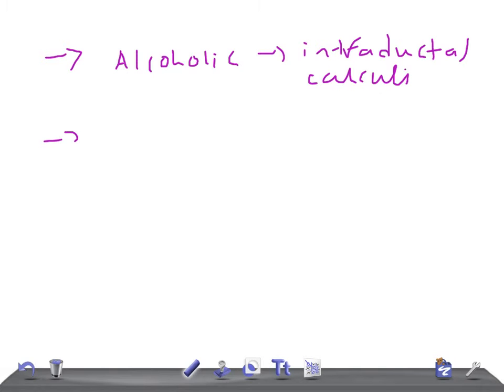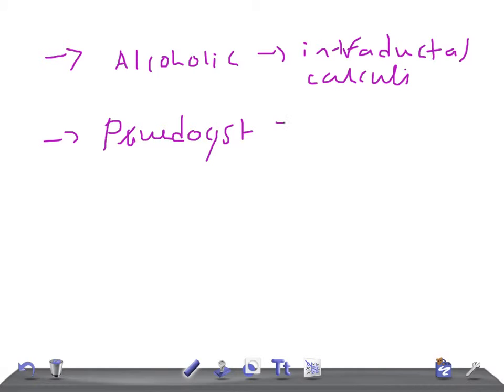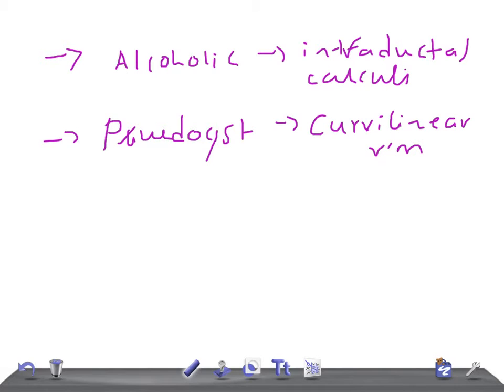Then we have cysts, which can give rise to pancreatic calcification. This may present as a curvilinear rim calcification, and it is most of the times due to chronic pancreatitis.